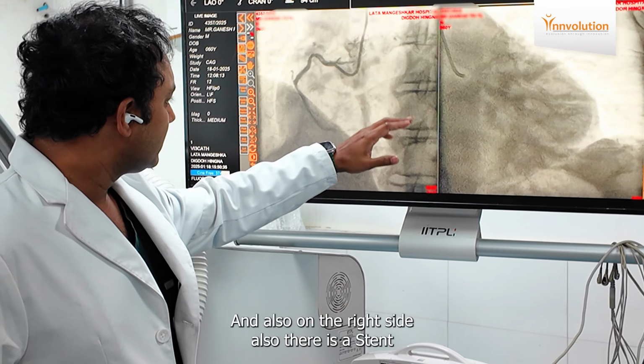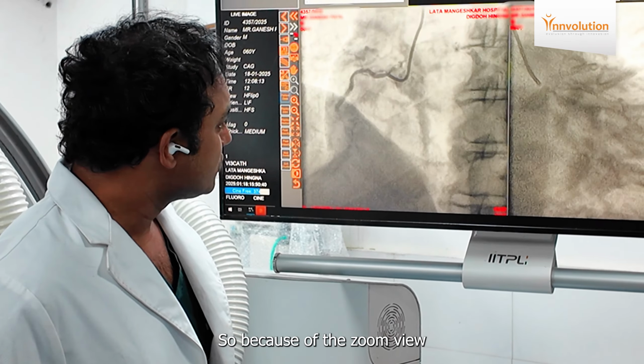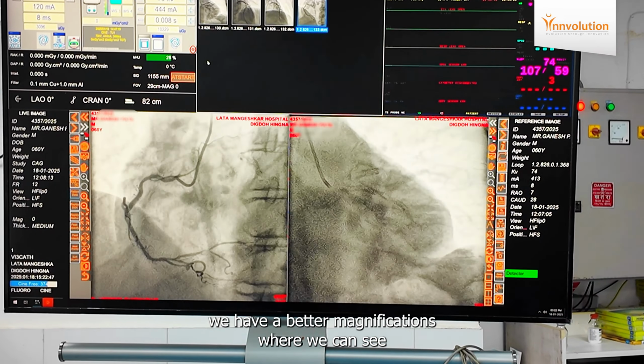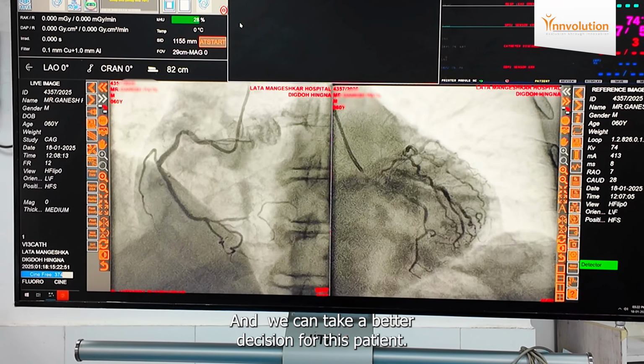Also on the right side there is a stent, and before the stent there is a 70-80% blockage. Because of the zoom view and the enlarged view, we have better magnification where we can see better pictures, and we can take a better decision for this patient.